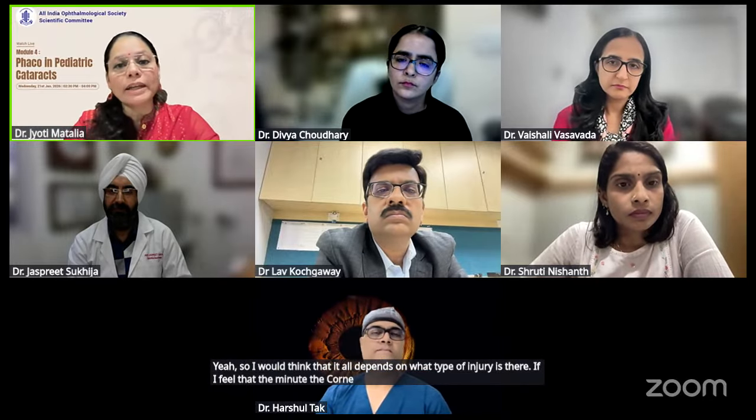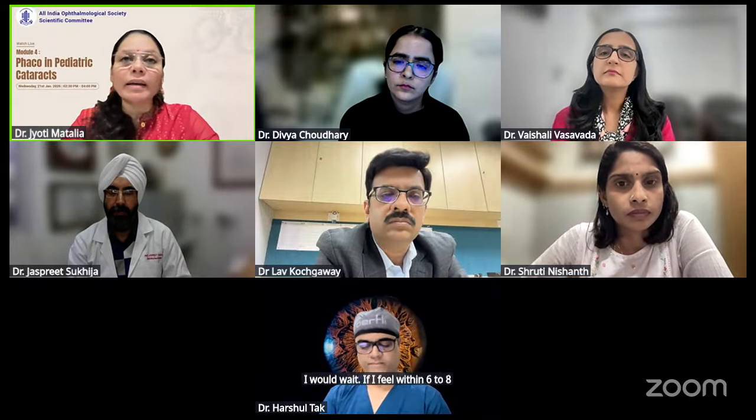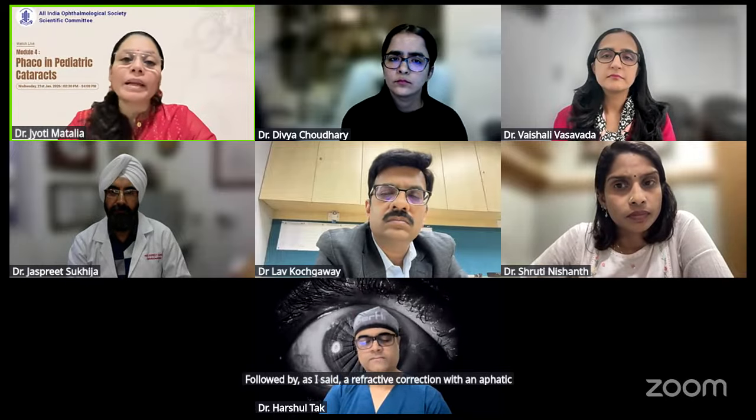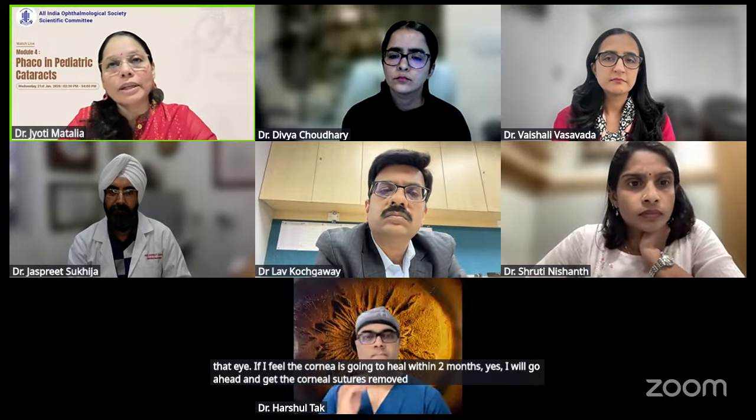If the corneal suturing is done, I would wait. If within 6 to 8 weeks I'm not getting healing of the cornea, then I may go in and do a lens aspiration, followed, as I said, by a refractive correction with an aphakic correction for that eye. If I feel the cornea is going to heal within 2 months, yes, I will go ahead and get the corneal sutures removed, and 2 weeks later do the surgery. That's one thing which I can do.